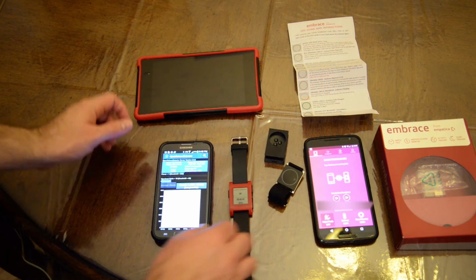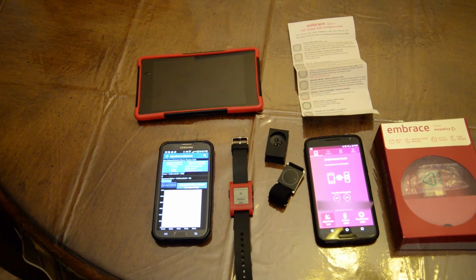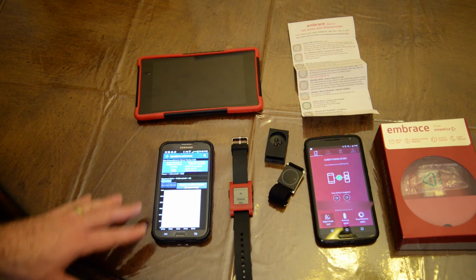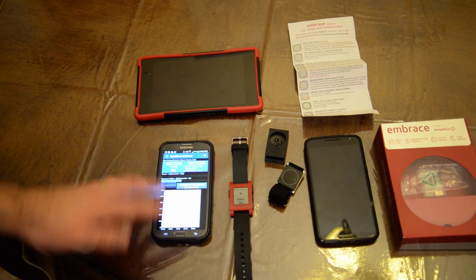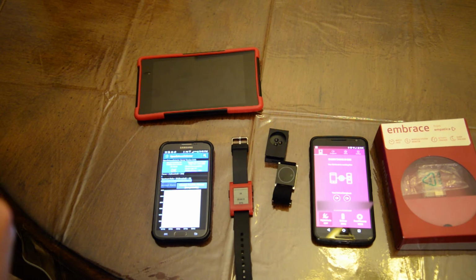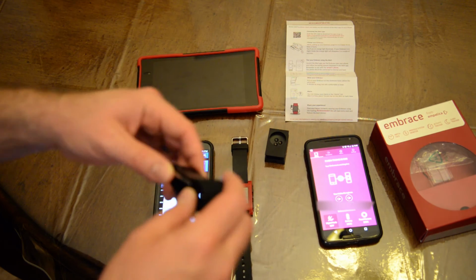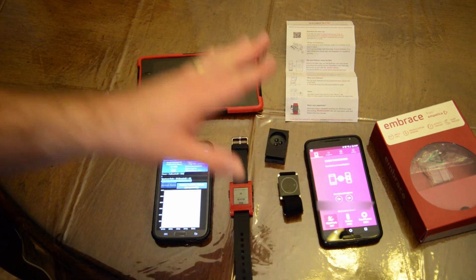In terms of alert, this one relies solely on movement. Depending on how accurate the movement is, that will determine the false positives to the false negatives to how accurate this device will be. So you have to tweak it yourself in some respects. A lot of it is a bunch of self-maintaining. This one right here claims to be much more advanced. It does claim to go off when an unusual event occurs. We don't know what that means actually, but since it does have these little sensors in the back, it does track more than just motion, which should benefit you in the long run.